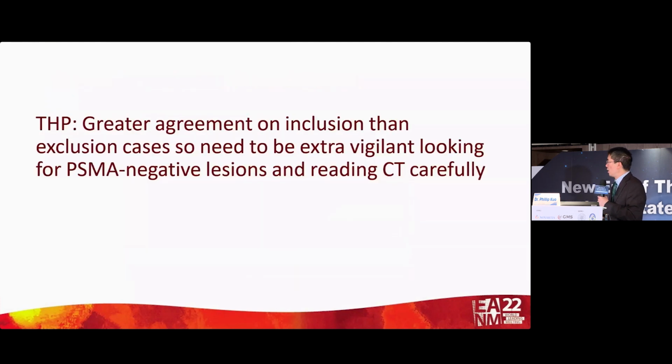But overall, when I looked at why, the greatest reason for people being discordant was that they missed the CT finding, okay? And these readers had to read all these scans in just a short weekend. So they probably got a little bit tired as well. So try to do this when you're fresh.